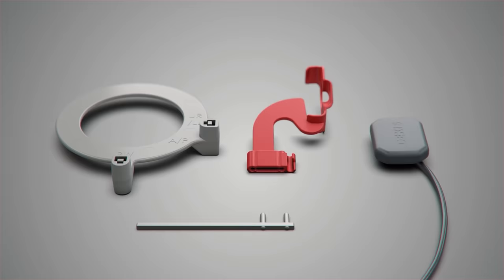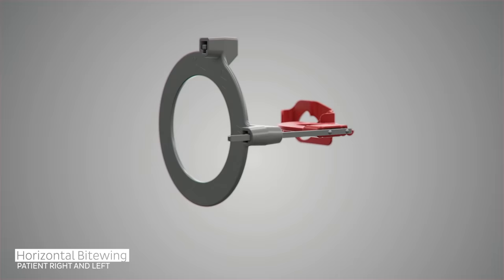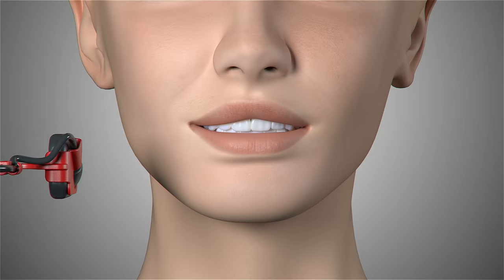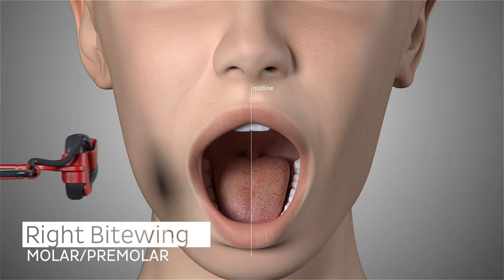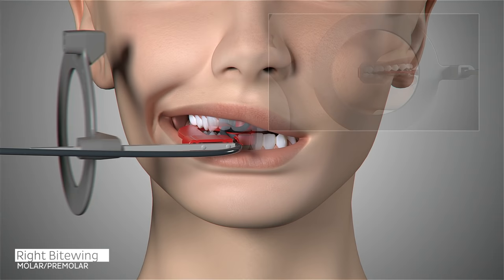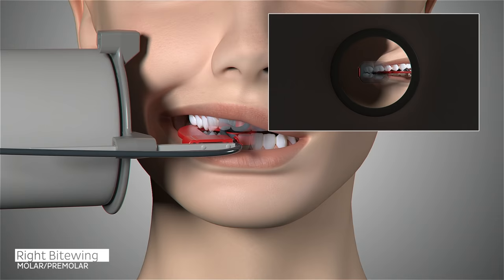The configuration of the sensor and holder will now change for the next set of images in our series, the horizontal bite wing. We will use the straight bite wing aiming bar in the red horizontal or vertical bite wing bite block. Position the sensor so that it is parallel to the occlusal line, center the sensor on the second molar, move the sensor toward the palatal midline, and ask the patient to close. Slide the aiming ring close to the patient's face, position the x-ray emitter cone flush with the aiming ring and trigger your exposure.